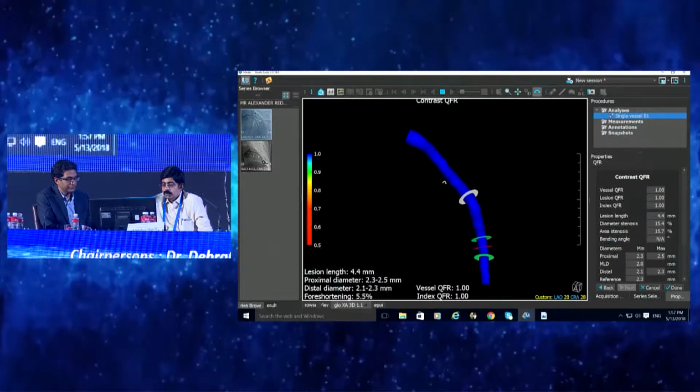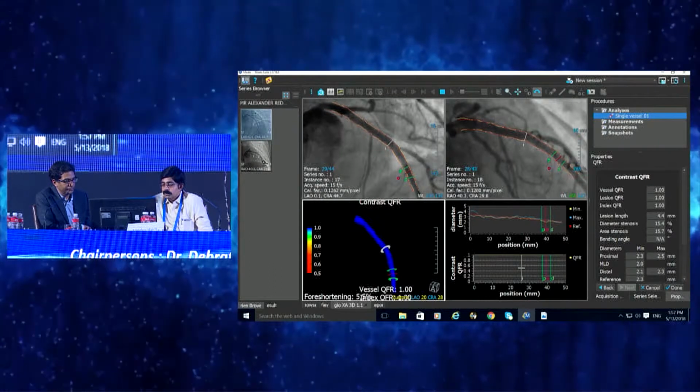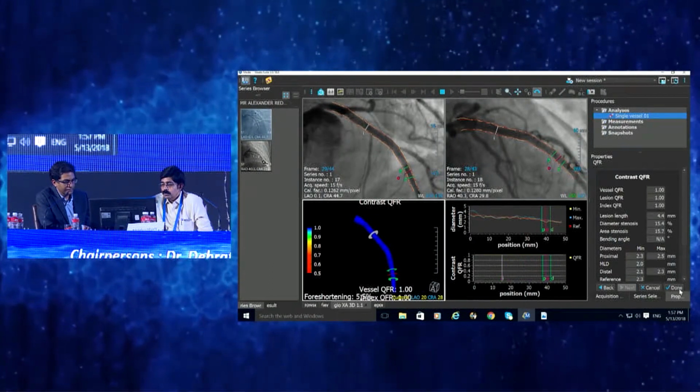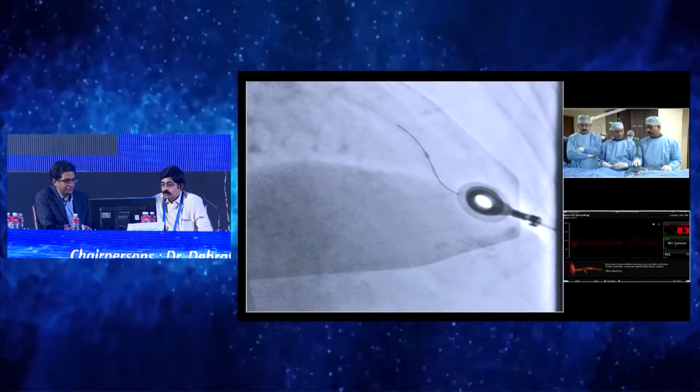If you want to break or go to Calcutta, you can do that. Thank you, Ramesh. Thank you very much. That's a very good demonstration. The plan further is next we will do that OM stenting, and then check RCA also, FFR and QFR, then decide whether to stent that also. Mostly we might end up stenting that too.